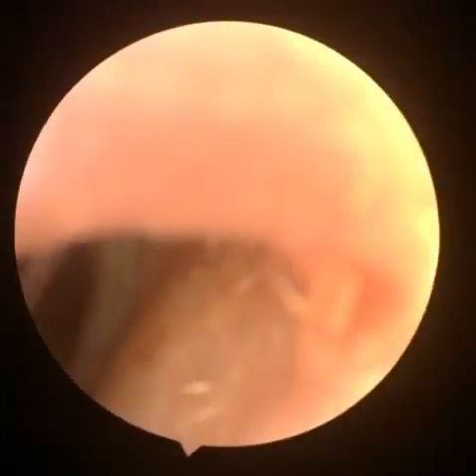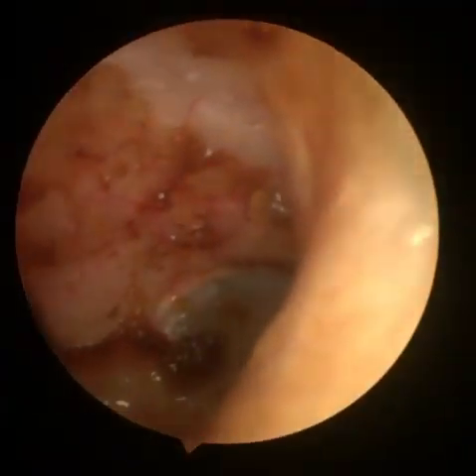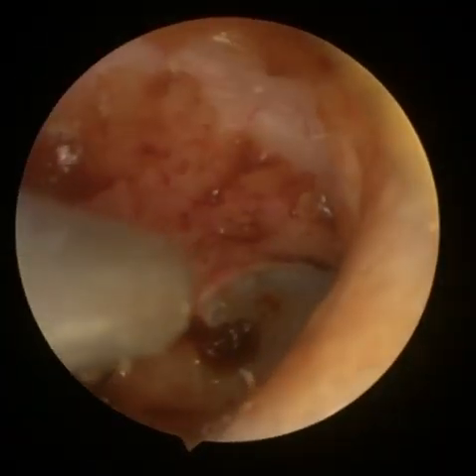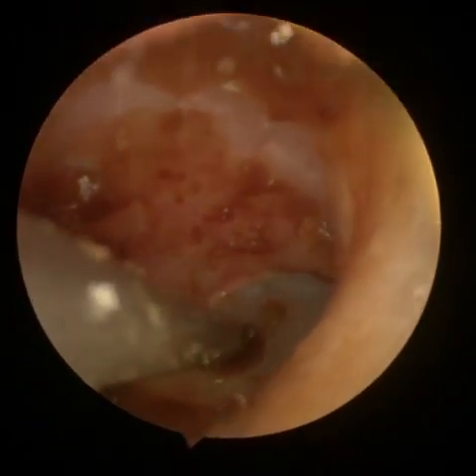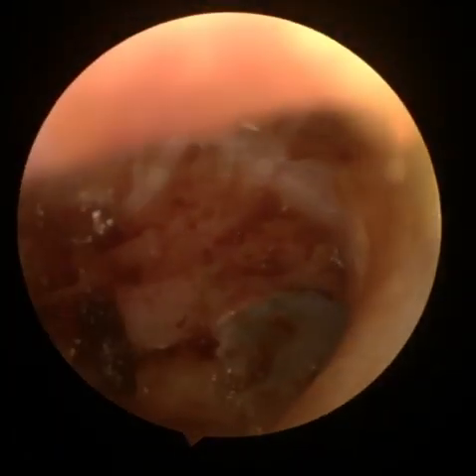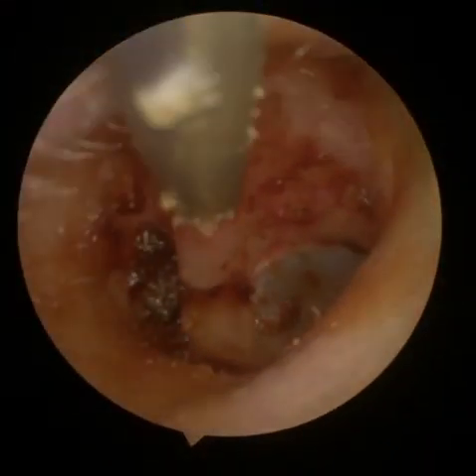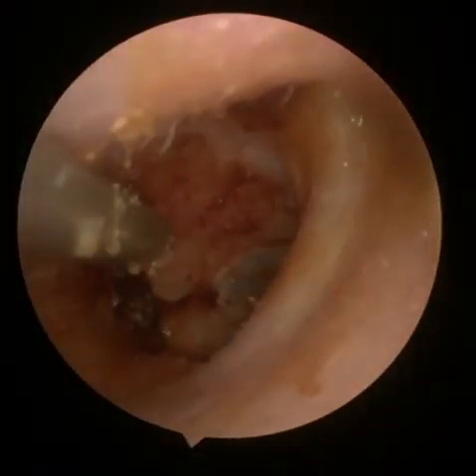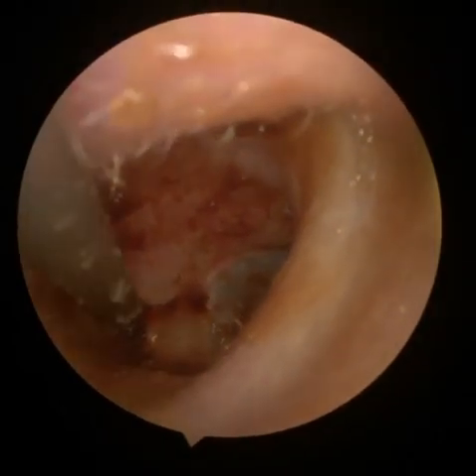You'll certainly see the retraction of the pocket there — just give it a second. As we go in, there — you saw that drum move ever so slightly. This is the reason why you've got to be so careful and have the right type of equipment, especially when you're doing wax removal off the eardrum. And that was case study one — thank you.